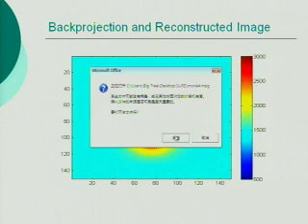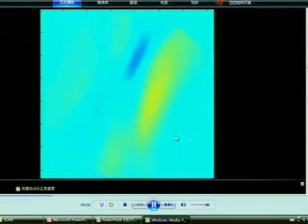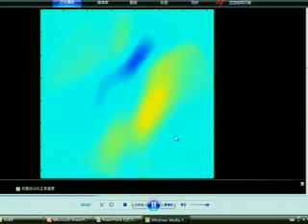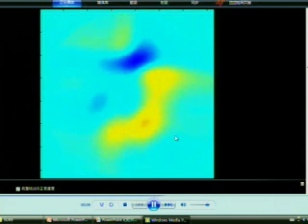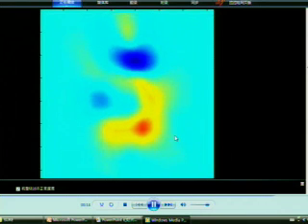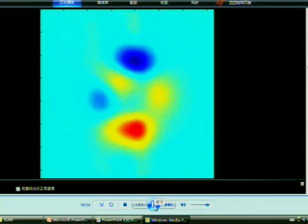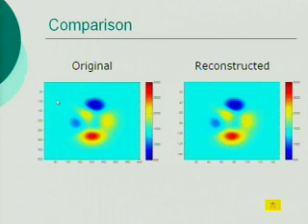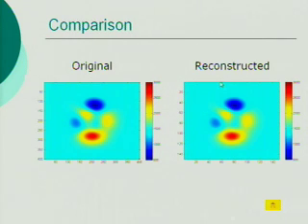This is how MATLAB did it — you can see it's rotating. MATLAB performs the back projection at each different angle and then superimposes them. That's the final result. Here is the comparison between the original and the reconstructed one. The only difference is the resolution, so in order to increase the resolution, you need to increase the number of transmitter-receiver sites.